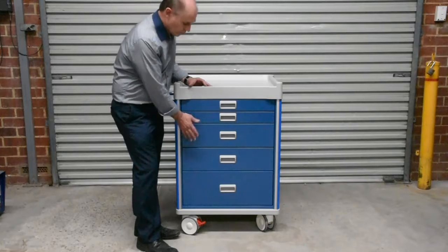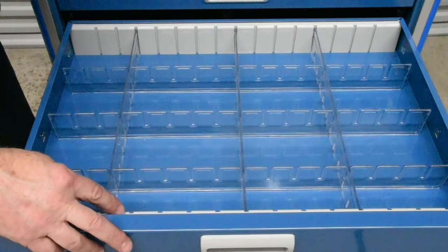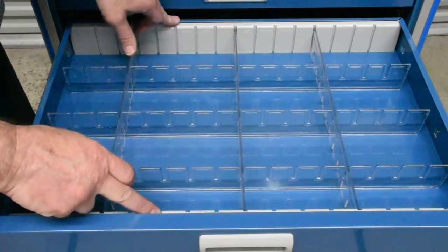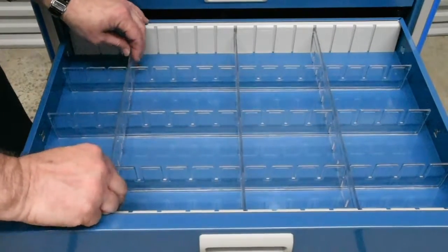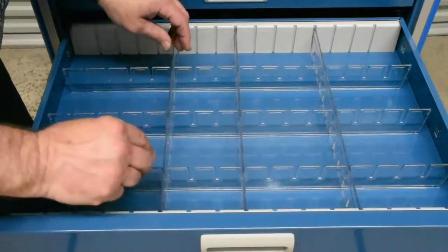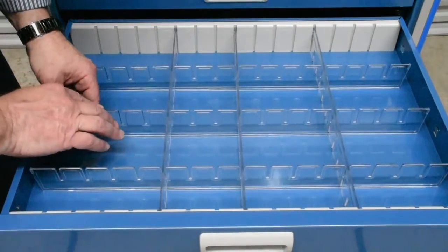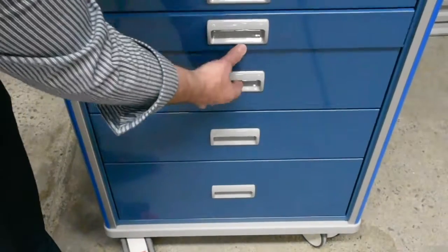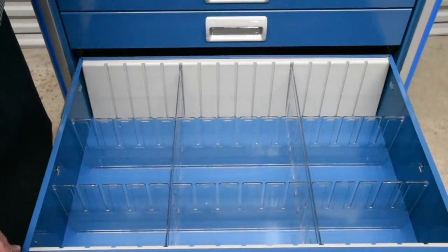Drawer dividers are provided for two drawers — one for the seven and a half centimetre drawer and one for the 15 and a half centimetre drawer. Here's the drawer divider kit for the seven and a half centimetre height drawer. There are two guides and these adjustable dividers, which can be moved around just to suit yourself. The long ones are a bit trickier to do, but you can do those.